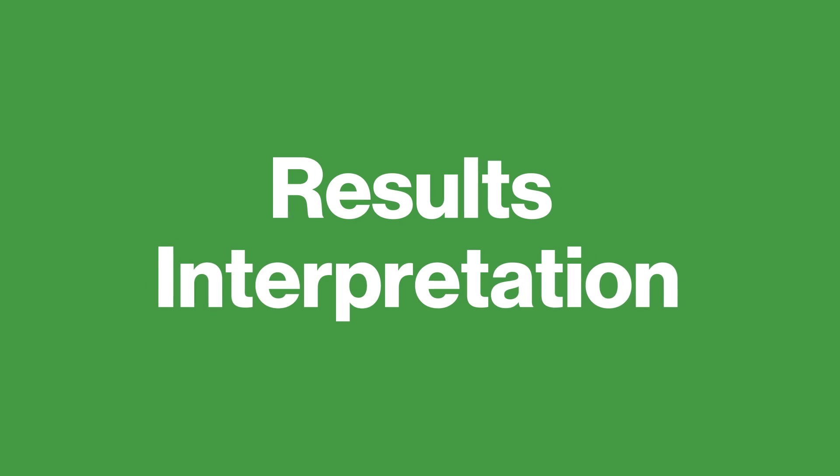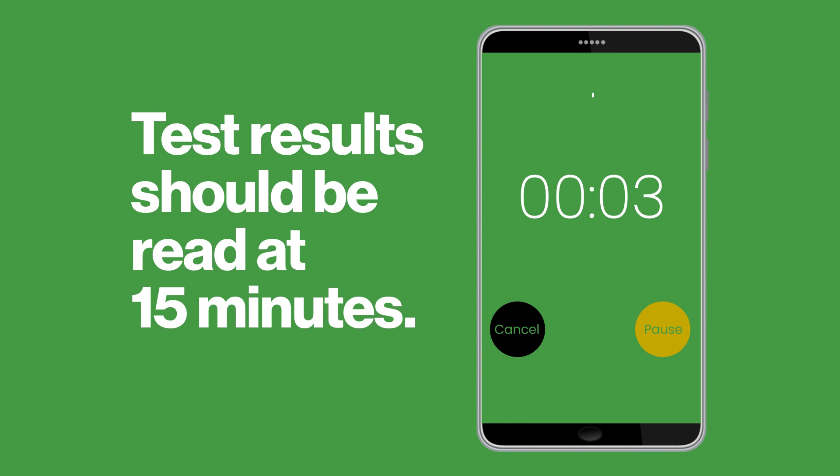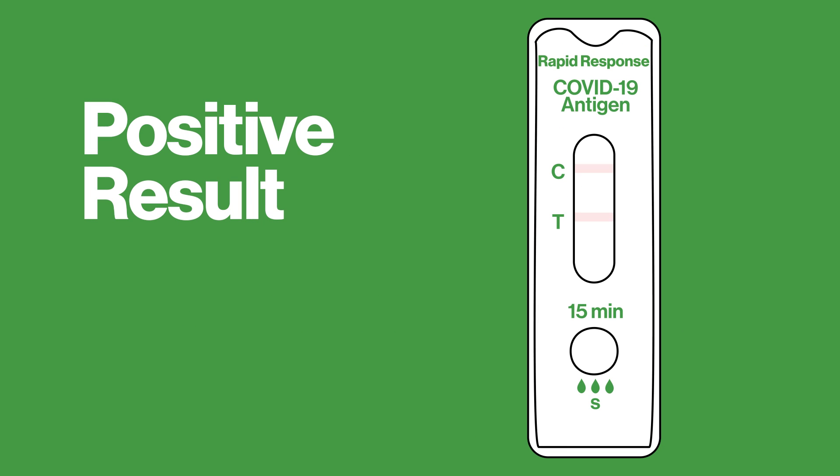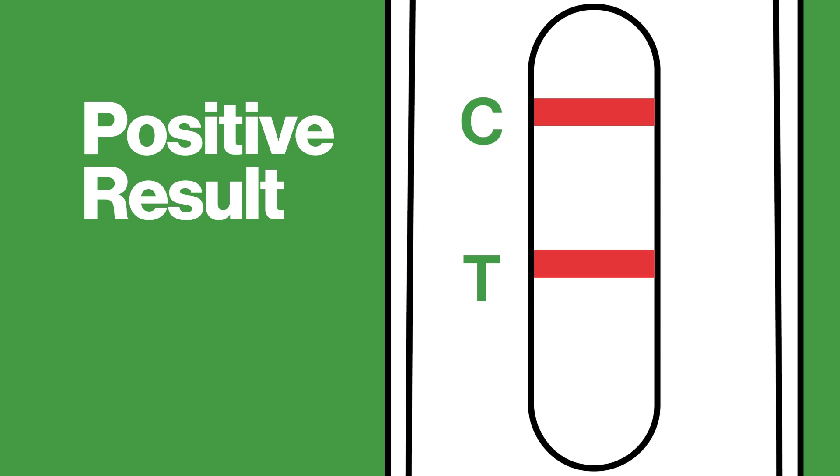Results interpretation. Read the results 15 minutes after you added the sample to the sample well. Results interpretation is easy. The test result is positive if there are two colored lines, just like a pregnancy test. One line will appear in the control region, C, and another line will appear in the test region, T. It is important to note that the color intensity in the test region may vary depending on the concentration of viral particles present in the sample. Therefore, any line in the test region, no matter how faint, should be considered a positive result.